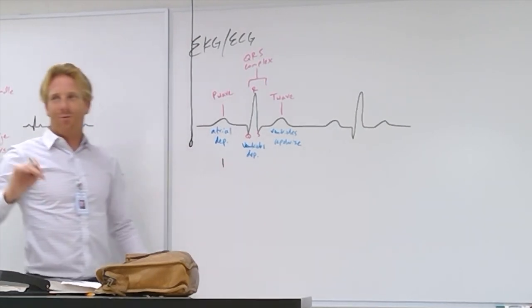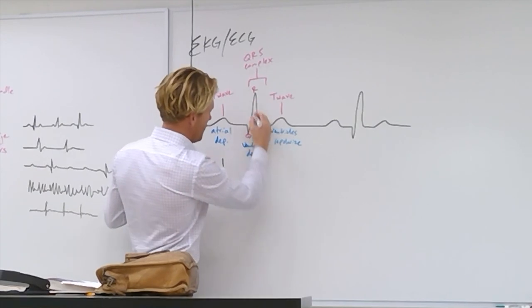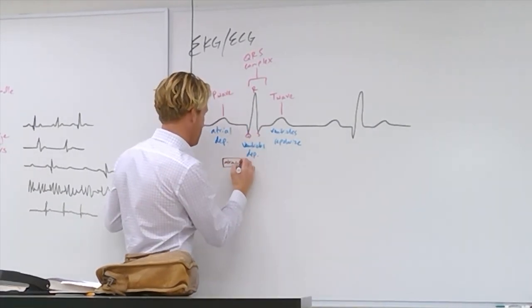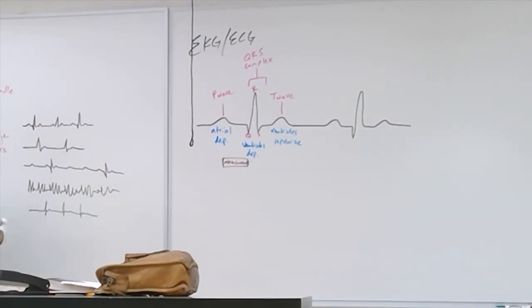When do the atria relax? Before Q, or like right about a Q. So then we're gonna say a box from here to there, the atria are contracting. Atria contract.